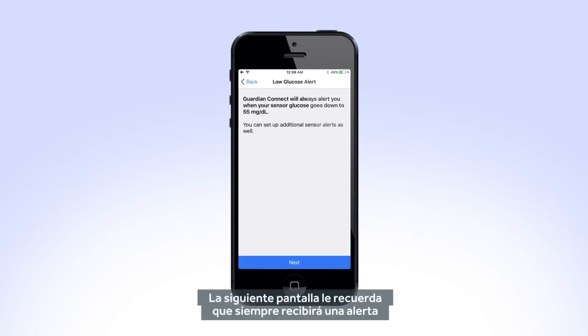The next screen reminds you that you will always receive an alert when your sensor glucose reaches 55 mg per deciliter. Tap Next.